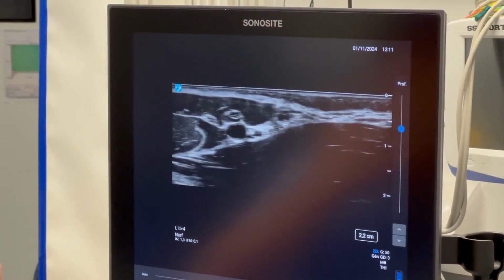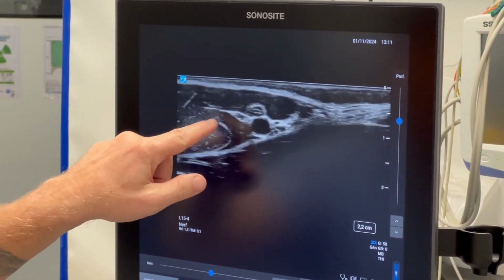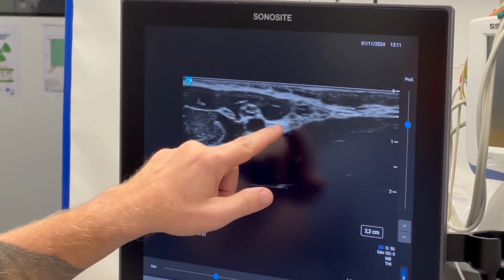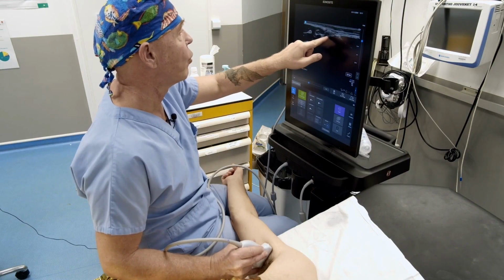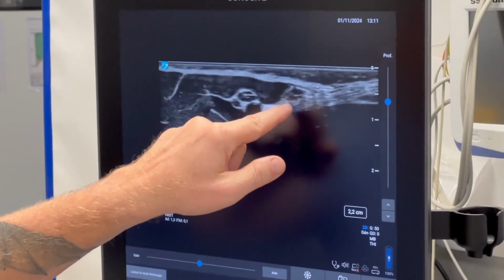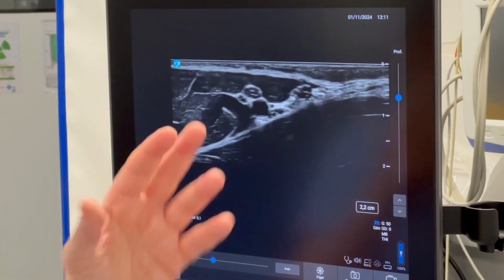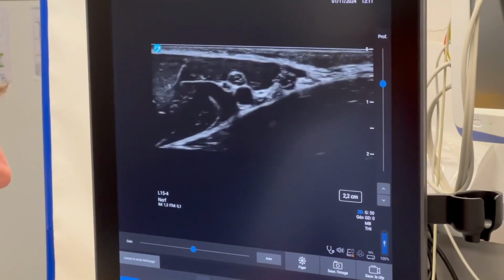In a significant number of cases, as you can see, it gets closer to the median nerve. Once again, we can identify the elements from step 1, namely the musculocutaneous nerve, which is clearly visible right here, and the median nerve, the radial nerve. When we tilt the probe just a little and follow dynamically, we can clearly see the anisotropy. Anisotropy is a concept I forgot to mention earlier. During dynamic tracking the nerve retains its properties, keeps its nerve shape. This is precisely what distinguishes it from a fascia or a tendon.